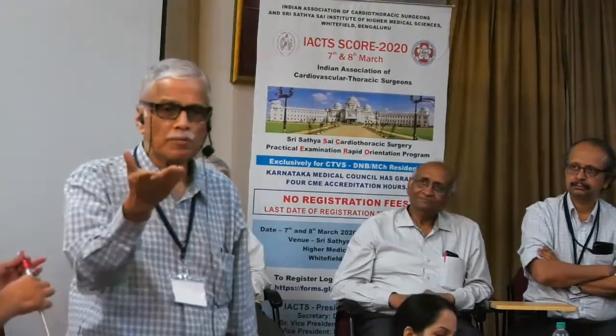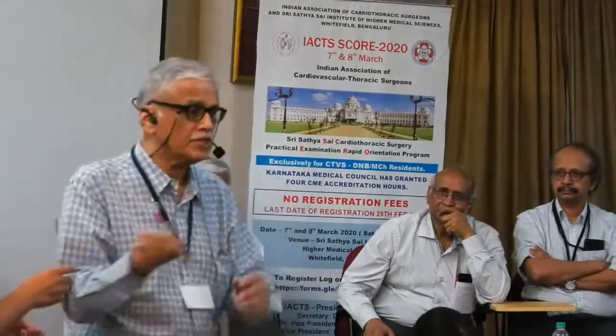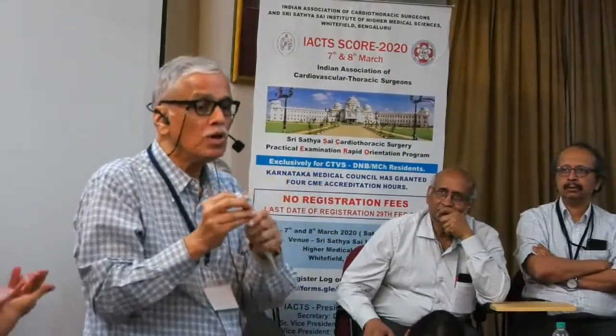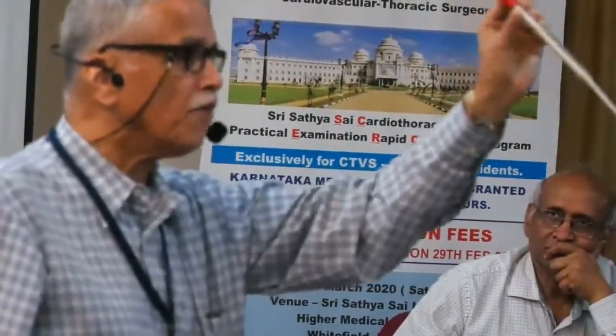Before that, anything else you can use it for? Apart from arterial cannulation, anything else it can be used for? It is used for IJV cannulation of the SVC because of its short length. That's why the new Medtronic cannula caps have replaced the red color with blue or white. So it can be used for both. The red color suggests that you use it only for arterial cannulation. You don't have the facility of ultrasound and you pass this aortic cannula.